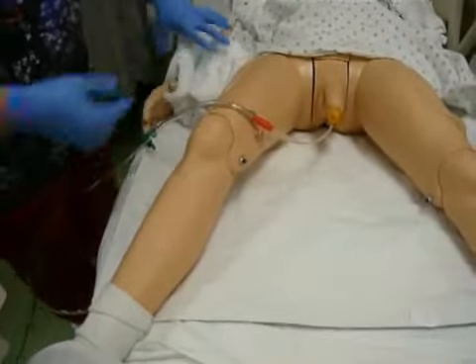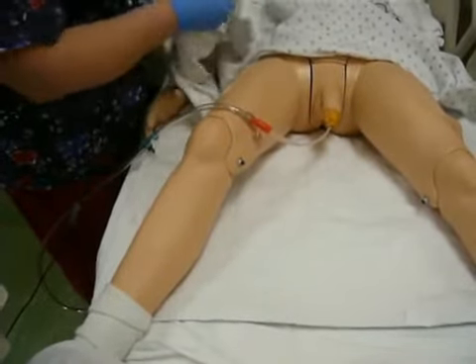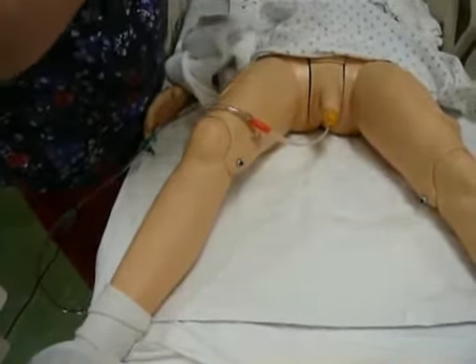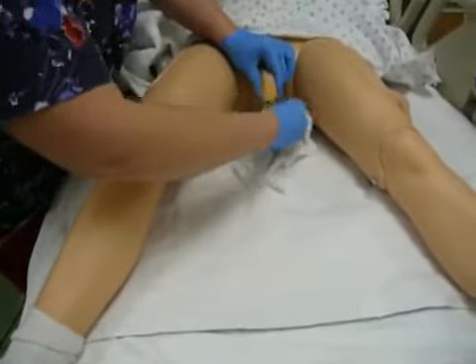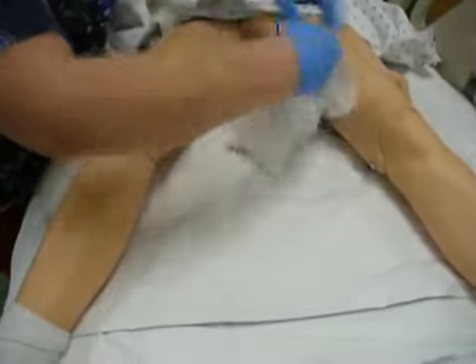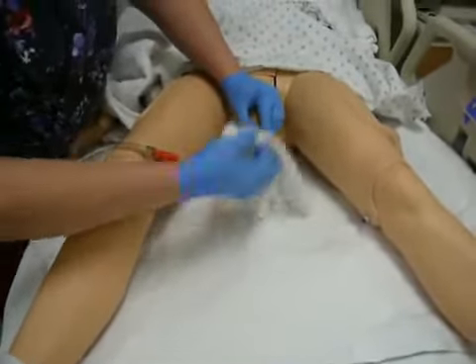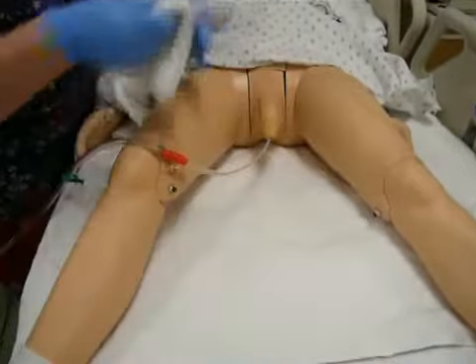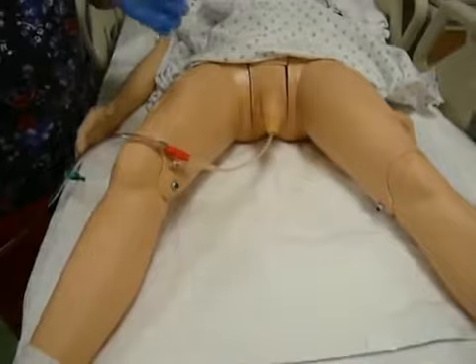And then last but not least, with my clean gloves, I'm going to wash him off and make sure that I get rid of all the iodine. So I take my washcloth, which is wrapped up in my towel, and I go around the tip of his penis, making sure that I reposition. I start at the base, and I come off, and I do that again. And then I make sure that I dry him off. My clean gloves come off.